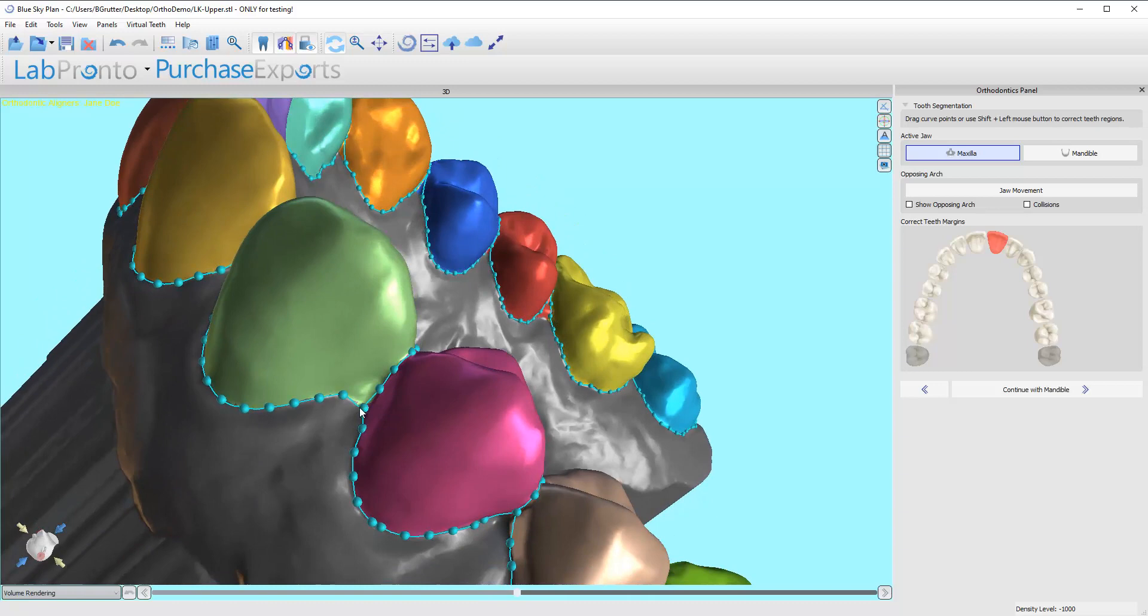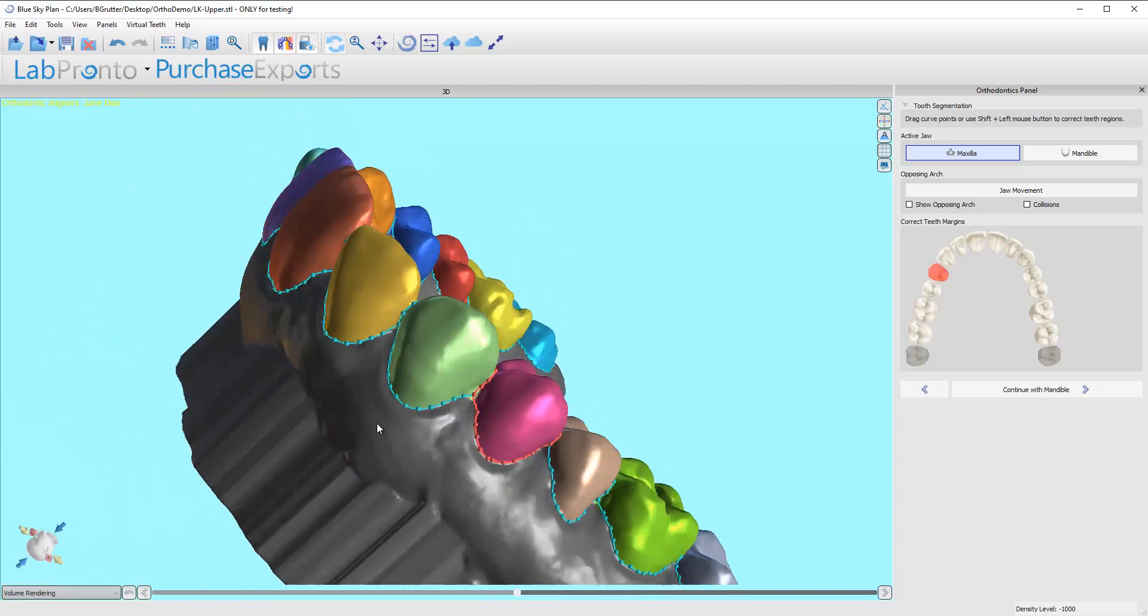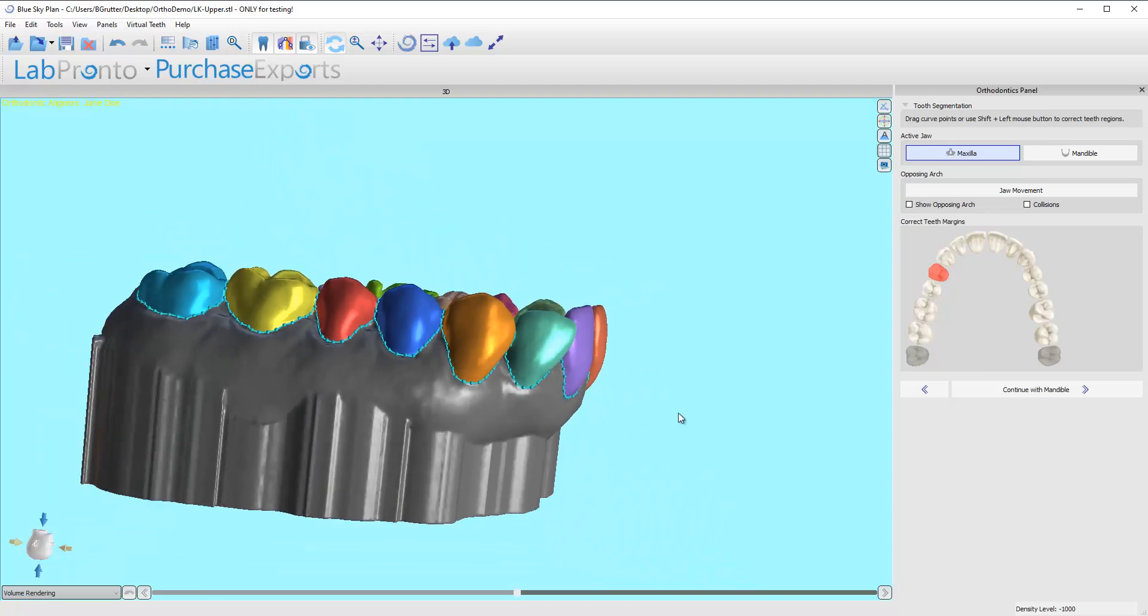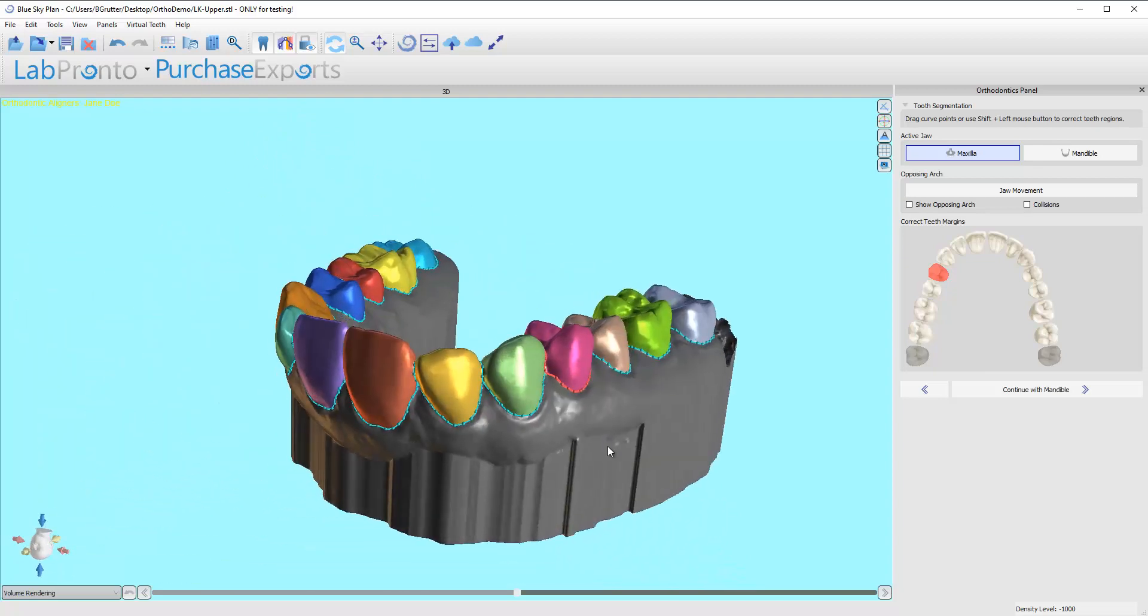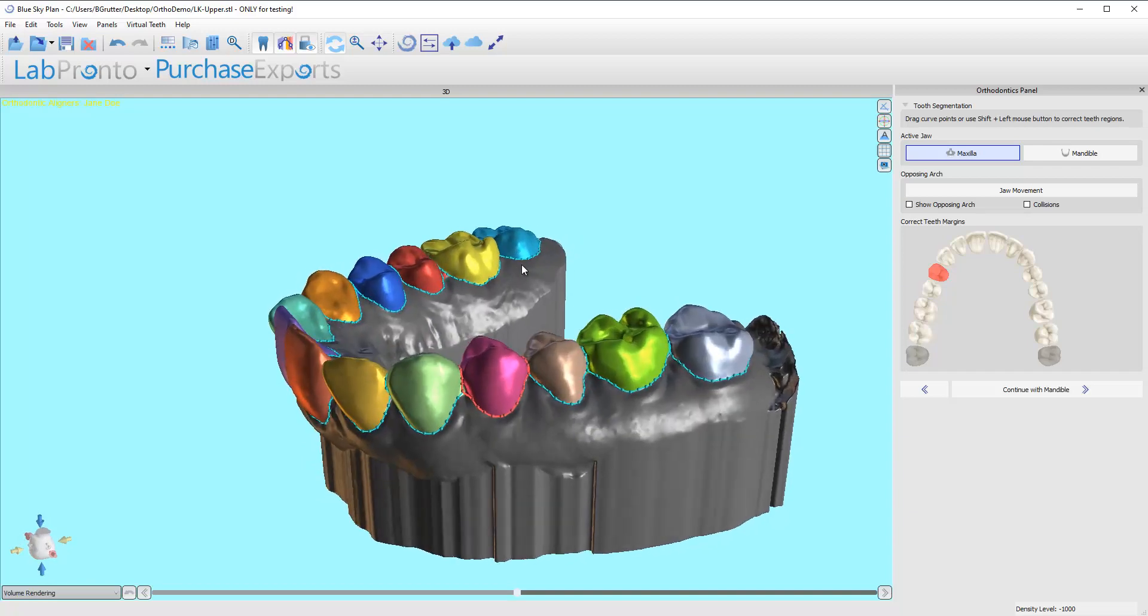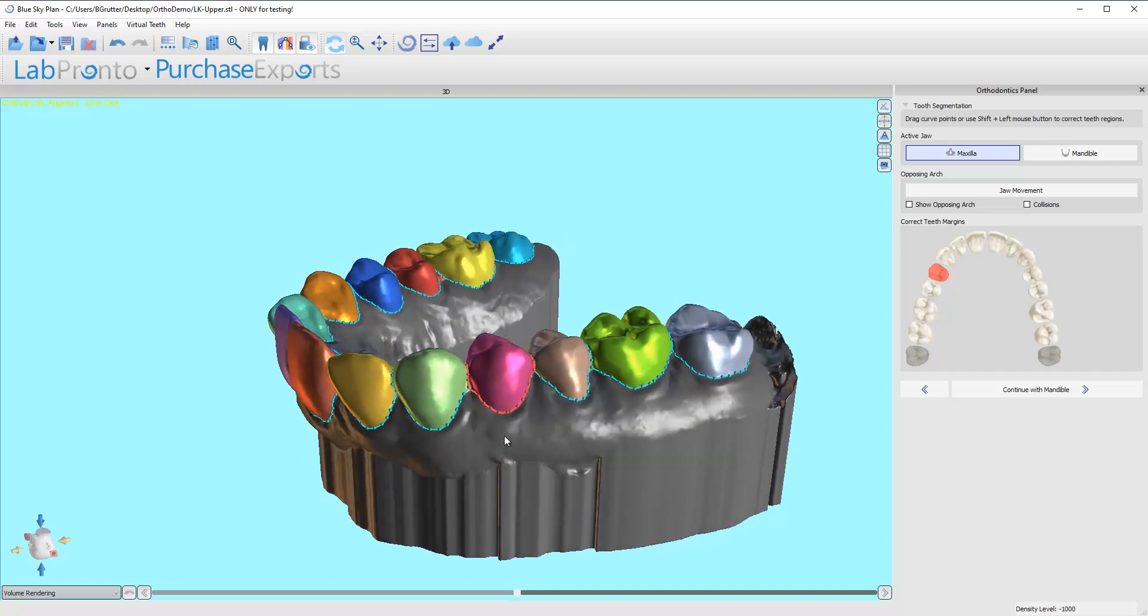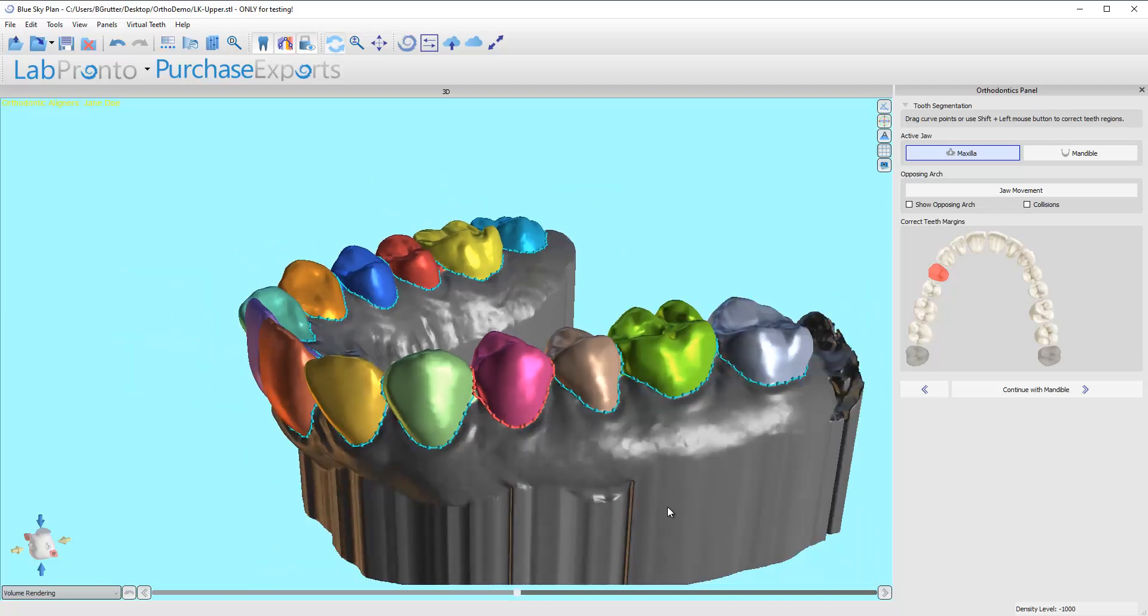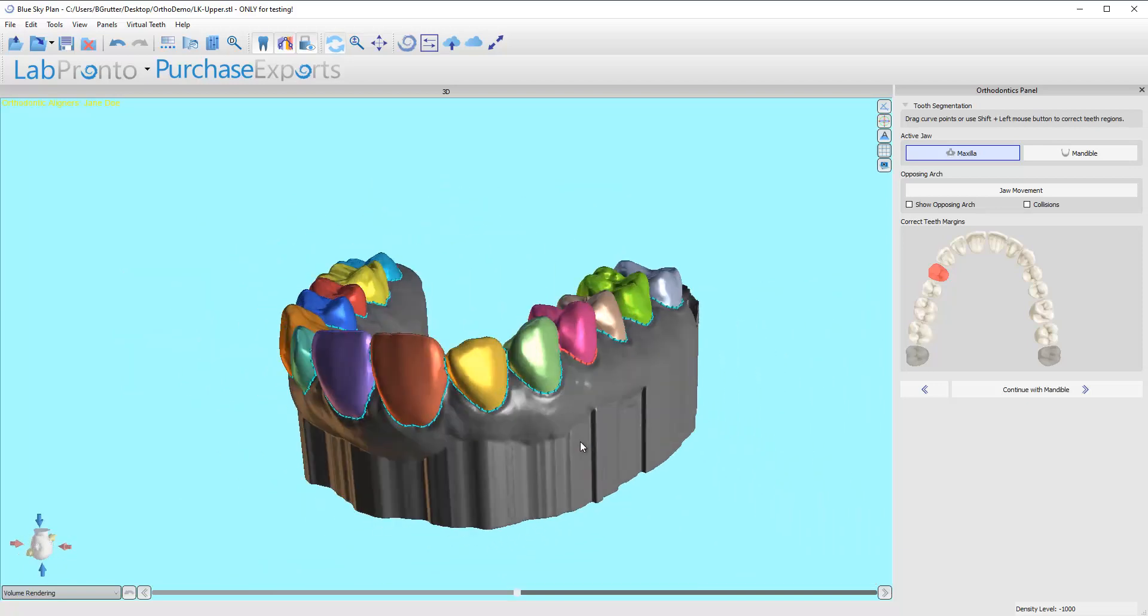Again, another little layer right here where it's not quite sure what to do. So I'm just going to move that up here and up there. And I think we're looking pretty darn good. If you have a case that has some significant gingival recession, you might want to go and look to make sure that it's not missing the root surfaces. That can happen.